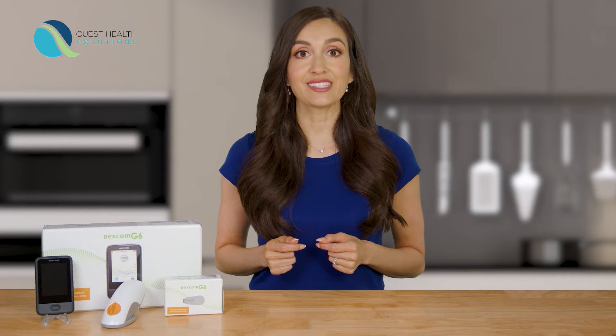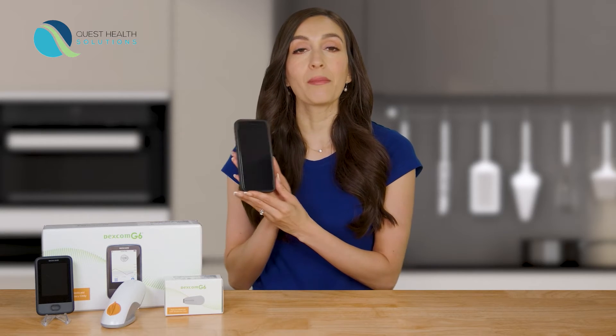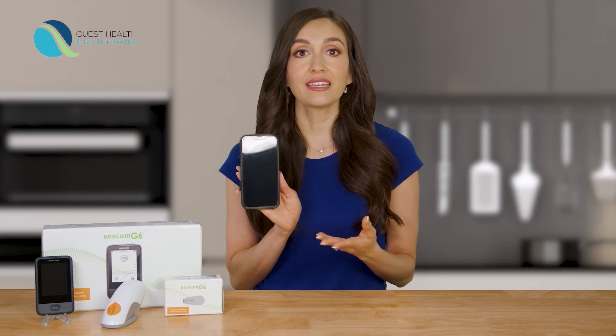In this video, I'm going to show you just how easy it is to get started with the Dexcom G6 app. You may pause this video at any time or replay any parts. To set up the app on your phone, first make sure you are using a compatible iPhone or Android device and double check that it is connected to the internet.